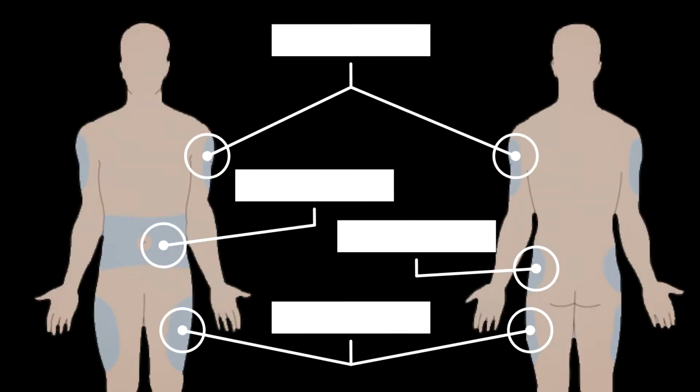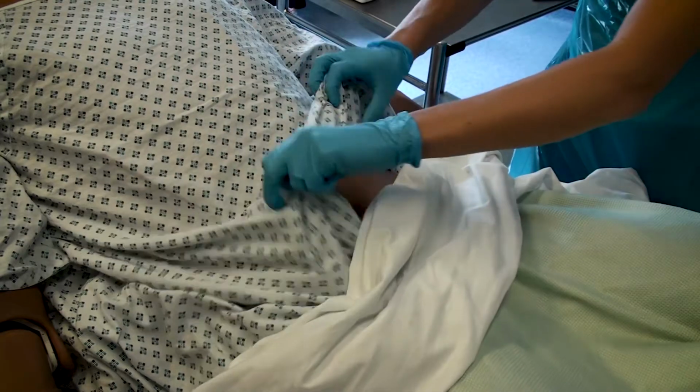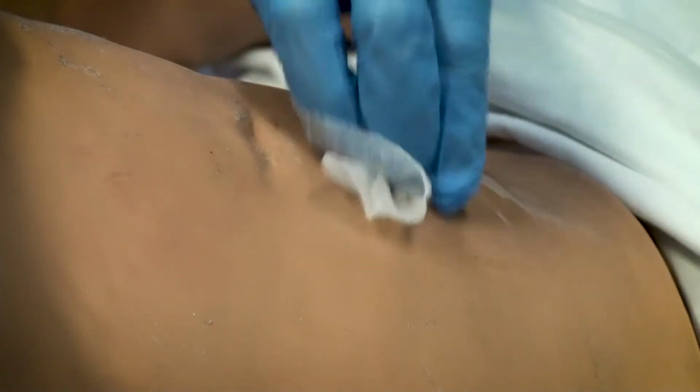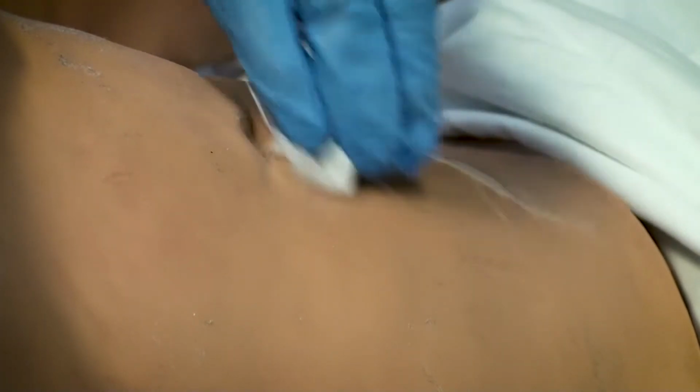Select the appropriate injection site. In this case, we are using the umbilical region of the abdomen as absorption is most rapid at this site. The skin must be cleaned if not socially clean, avoiding any areas of lesion or infection.